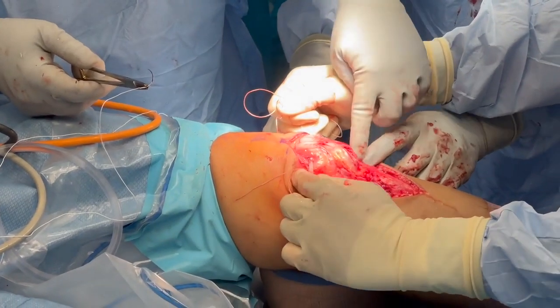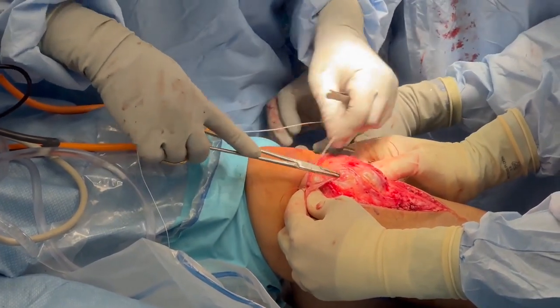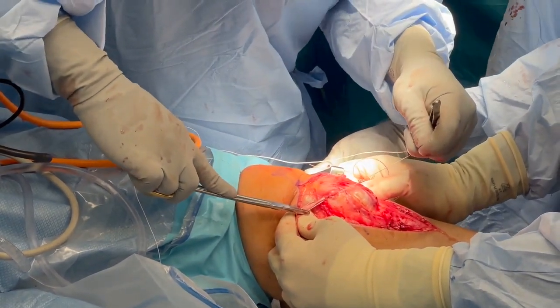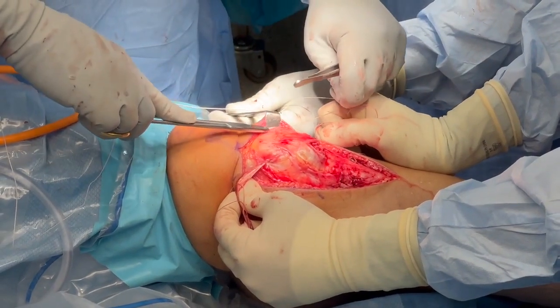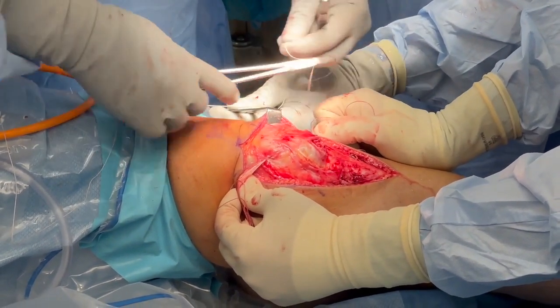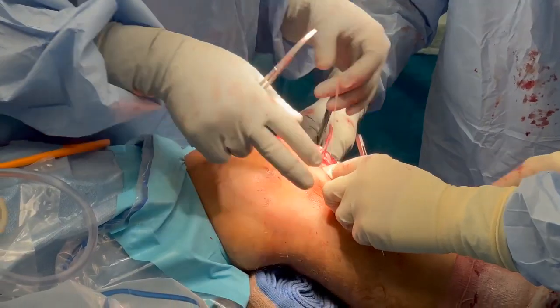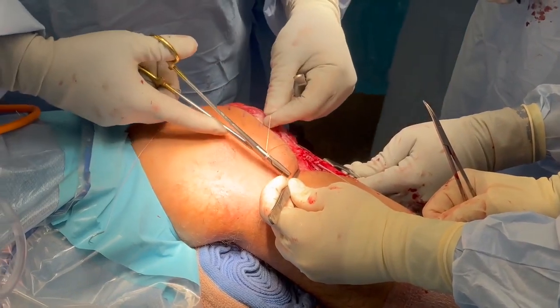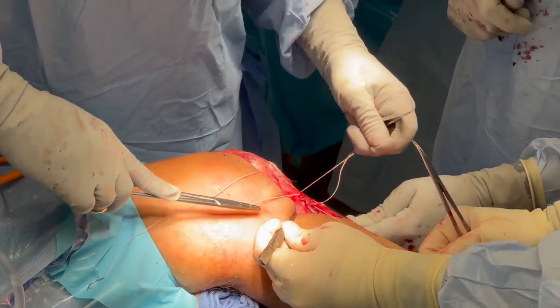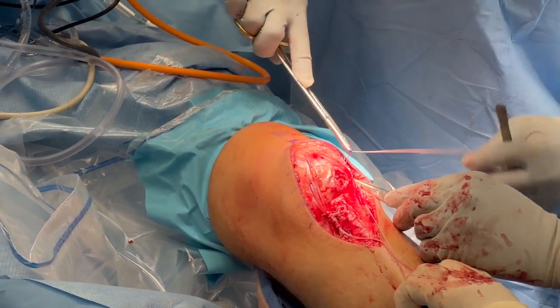Finally, the graft fixation for the patellar tendon reconstruction was completed. The grafts are sutured to each other at the entry and exit tunnels of the patella tunnel. During this step, it is critical to ensure the patella height is in the correct position and the grafts are taut during flexion of the knee. Once the grafts are tied to each other at the medial and lateral aspects of the patella tunnel, they are passed within the tissues distally along the medial and lateral edges of the original graft position. These extra portions of the grafts are then sewn into the grafts that were already positioned, which reinforces the reconstruction.